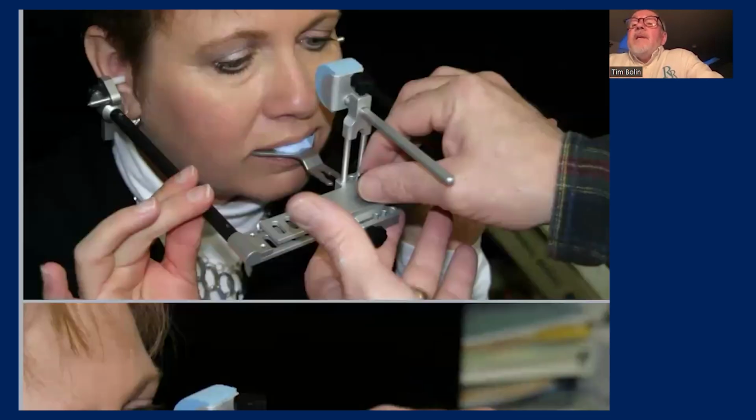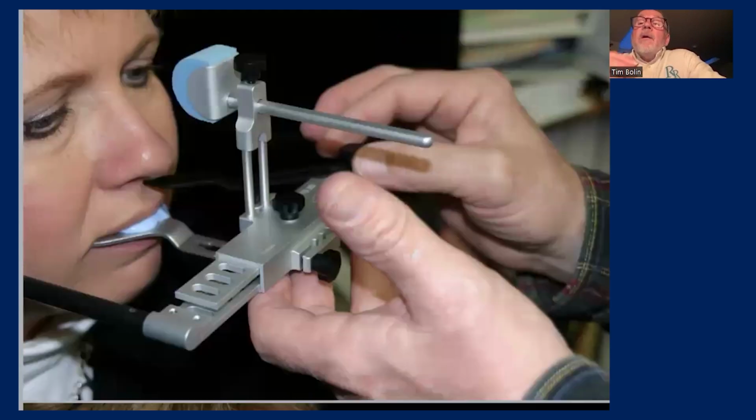Setting the Nasion piece. Quite often I don't utilize this piece. I just put it in here. I don't feel it's really necessary. This whole process takes about 30 to 45 seconds to complete. So I'm having the patient hold the transfer bow. Once I get the pointer placed on the anterior ANS, we're in good shape here. Now she can hold it up so she's comfortable and I'm not depressing that area.